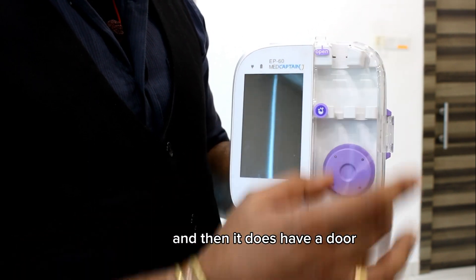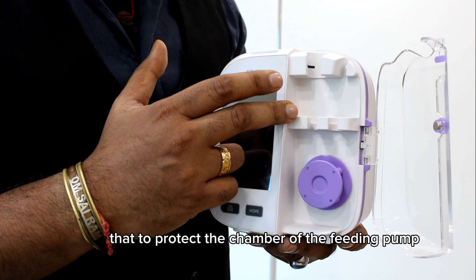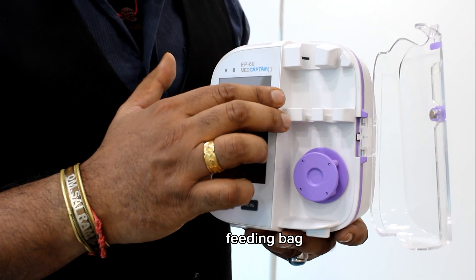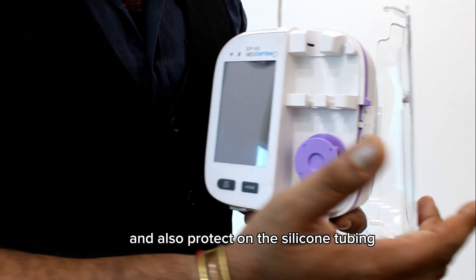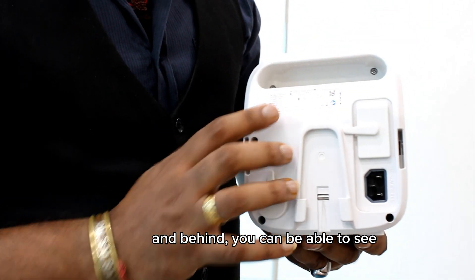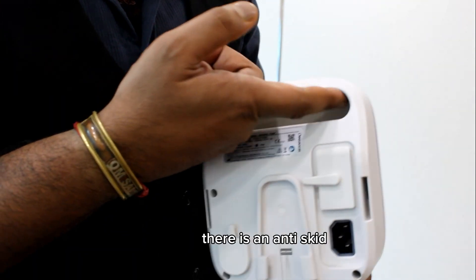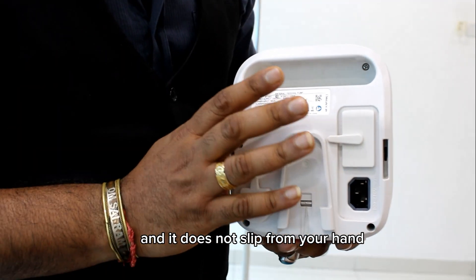The pump has a door that protects the chamber of the feeding pump, the feeding bag, and also the silicone tubing. At the back, you can see there is an anti-skid holder whereby you can hold the device and it does not slip from your hand.